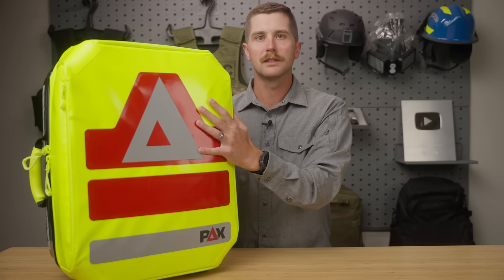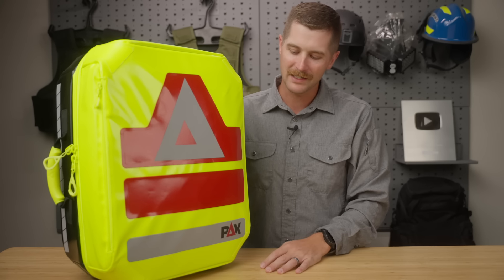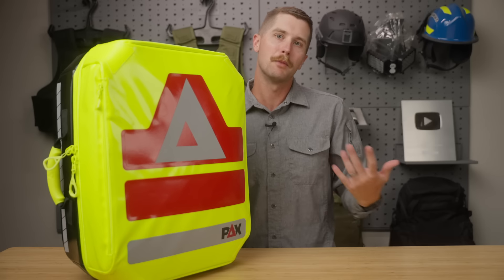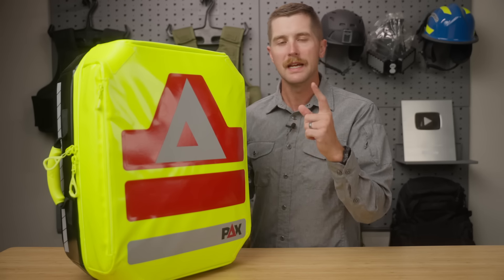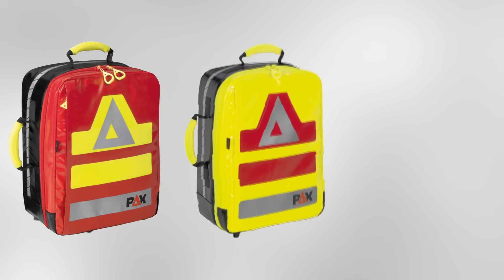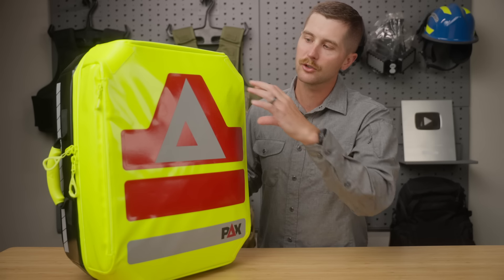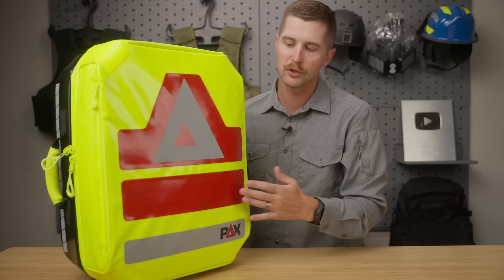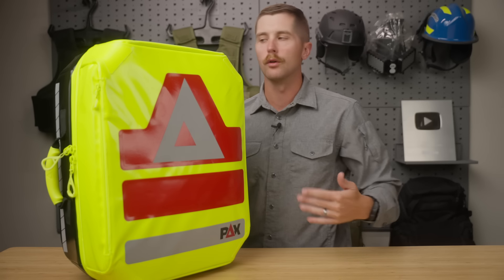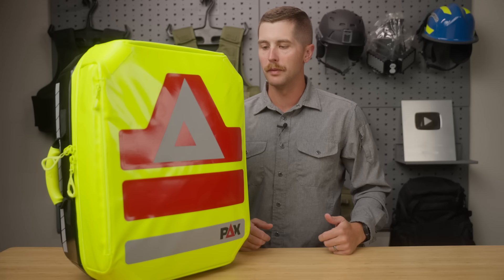You have bright reflective colors on the front. Early in my career I would have said I don't like the high-vis stuff, but as I have almost gotten hit on the highway multiple times, I'm starting to really value the high visibility aspect of a lot of these packs. This comes in a number of different colorways — all of them are just as bright as this. One of the really cool things you can do with this pack is get it customized. You can get lettering or numbers up here, lettering and numbers here, and then something put across right here — your company name, your certification, whatever it is — for a little bit of extra cost.